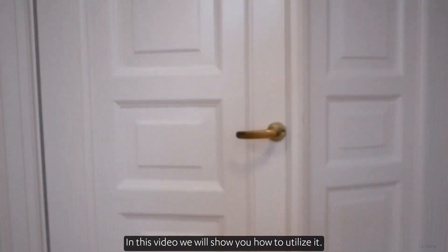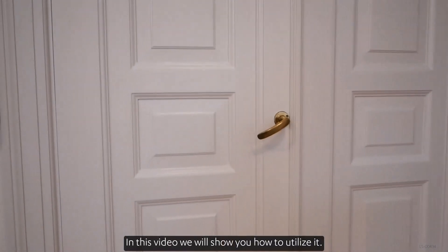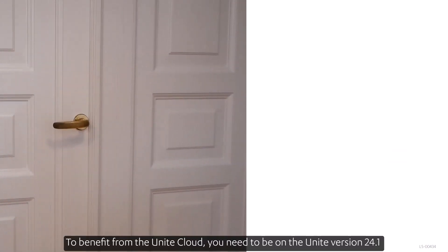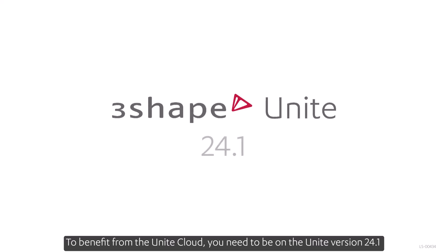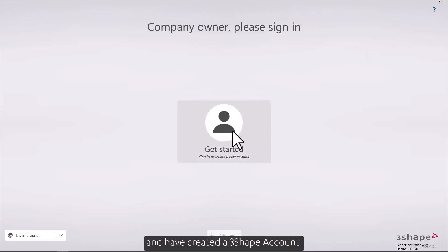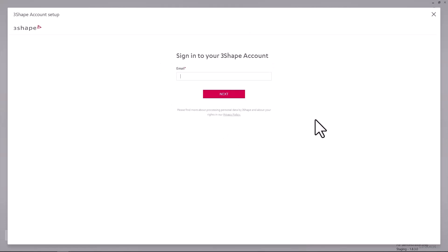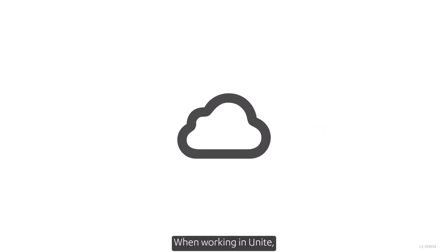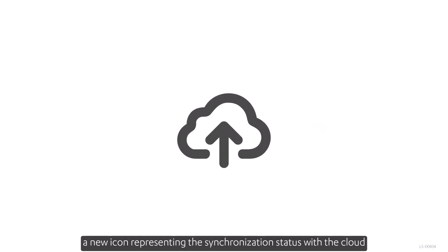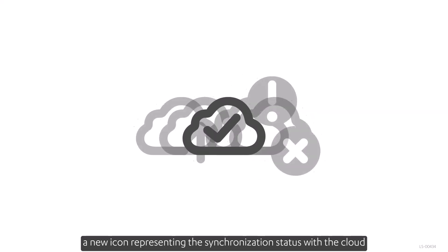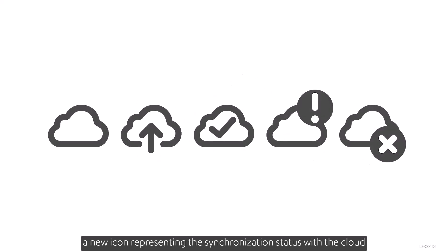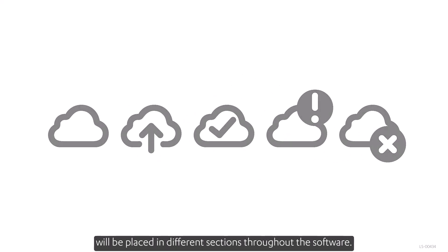In this video, we'll show you how to utilize it. To benefit from Unite Cloud, you need to be on Unite version 24.1 and have created a 3Shape account. When working in Unite, a new icon representing the synchronization status with the cloud will be placed in different sections throughout the software.